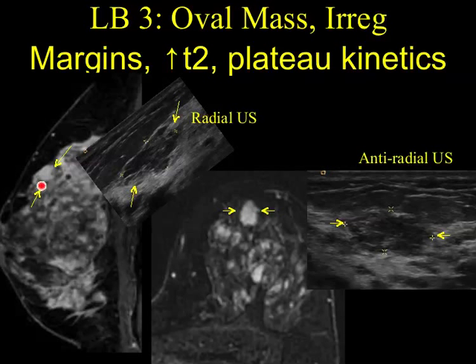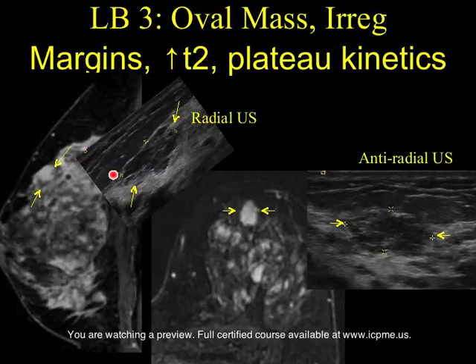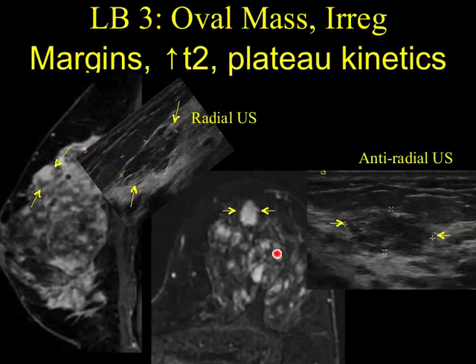Here's left breast lesion 3 at 12 o'clock. We see this oval-type lesion with a funny little notch in it, marginated by superficial fat. I've oriented the radial ultrasound to be more in line with the sagittal MRI. You can see that oval mass with the little notch corresponding to the notch on MRI, marginated superficially by fat. On the anti-radial ultrasound, because of gravity, this lesion is a little flatter than it was on the prone pendant MRI, but again very similar shape and indistinct margin features.